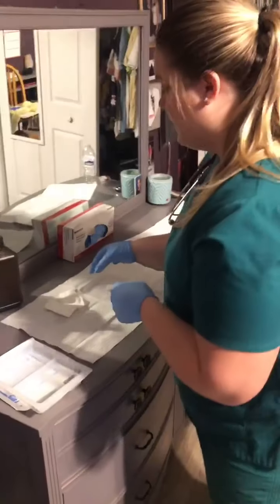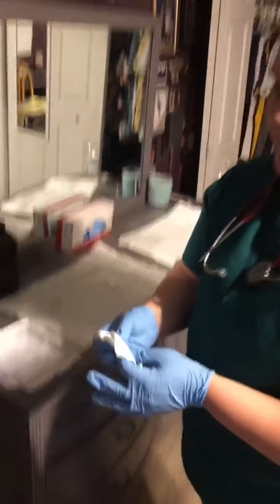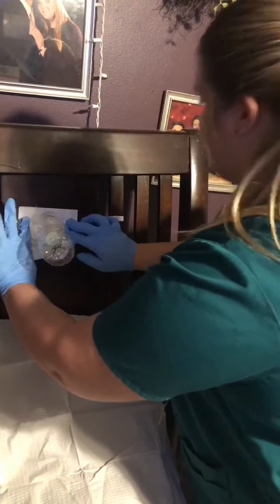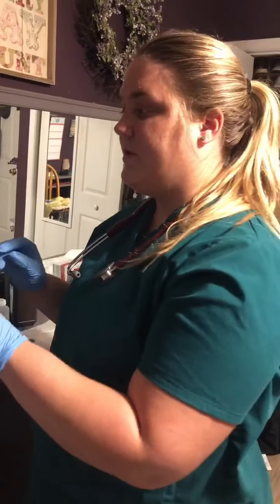So next thing I'm going to do is reapply the dressing that goes underneath the faceplate. I would never, in the hospital situation, cut a gauze to fit around there. I would always use the pre-cut ones because you don't want any of the fibers getting into the airway.